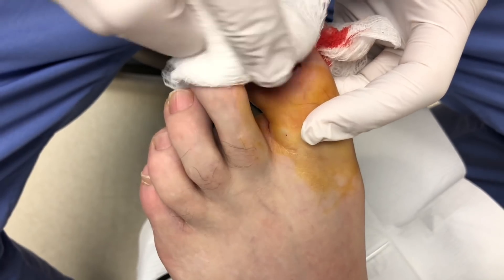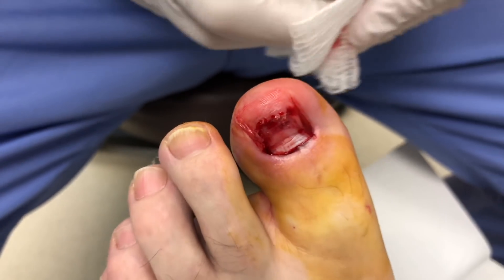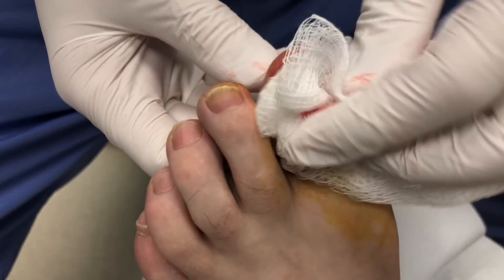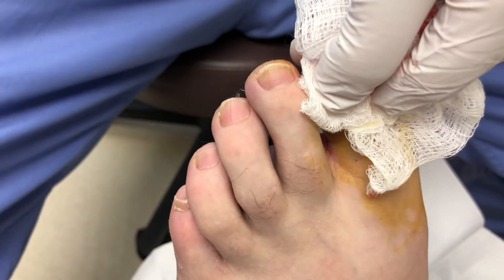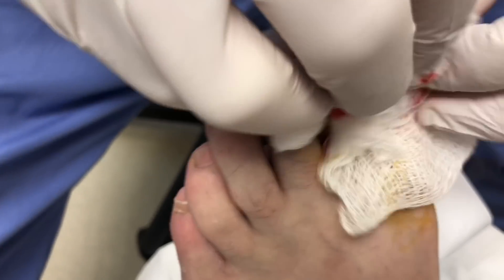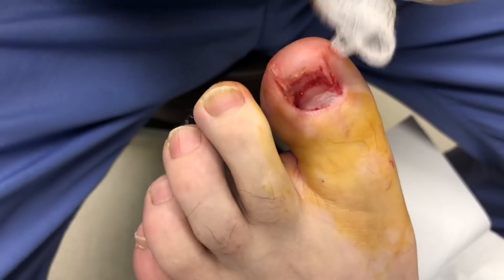Alright, so you can see all that blood and fluid is gone. So now we should feel a lot better, even though the way it looks. Now that that trapped fluid is gone, you should notice a big difference. We'll have him back in a couple weeks to check it, and then that should be it.